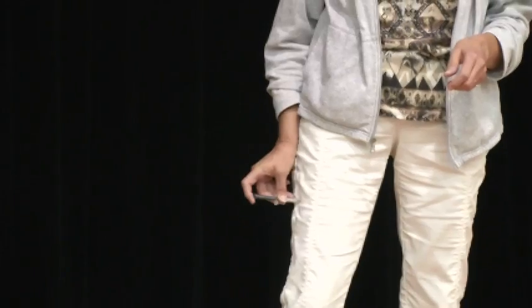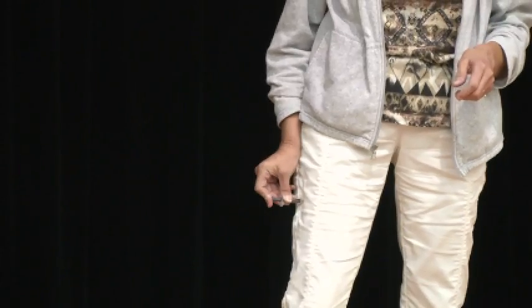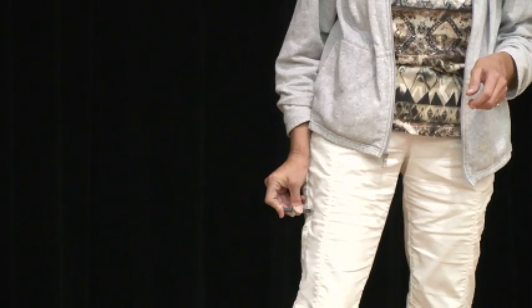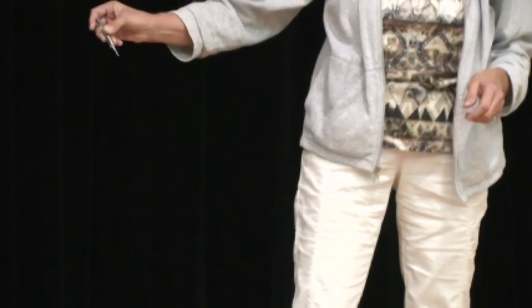So I always recommend that you go for the leg, because with EpiPens, people know leg, and I don't want you to be confused. But if you have presence of mind and know that this can go in the arm, you can inject it in there. Hold it like a dart, go through the skin, through the clothing if need be, then push the plunger. Once you push the plunger all the way in, you feel that resistance at the base, remove it, and put it back into the case that you got it out of.